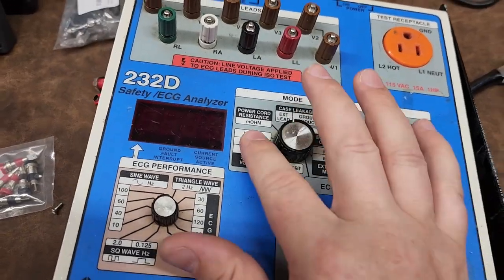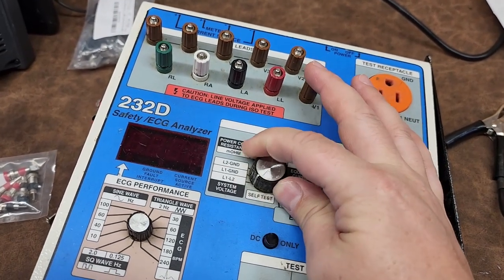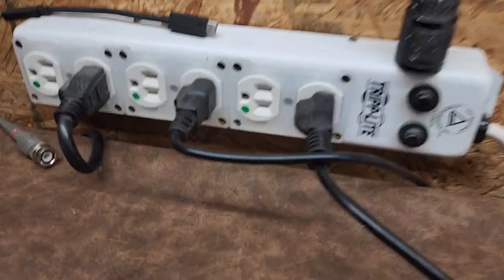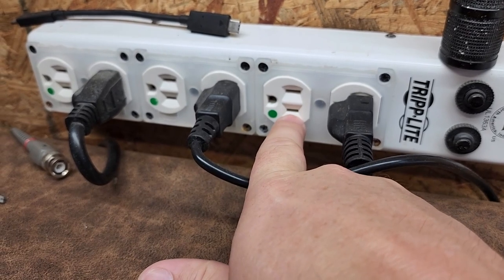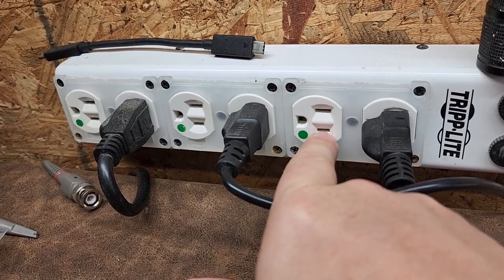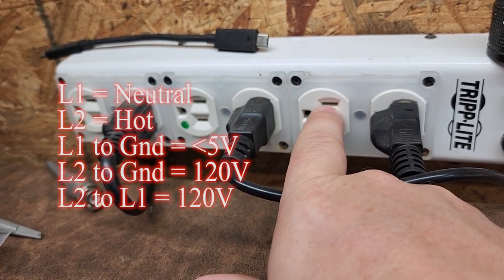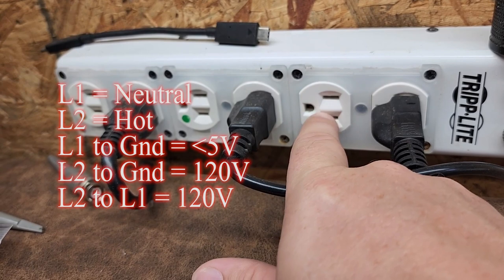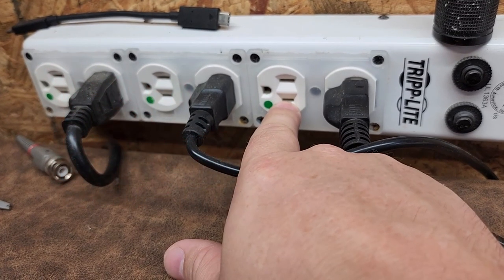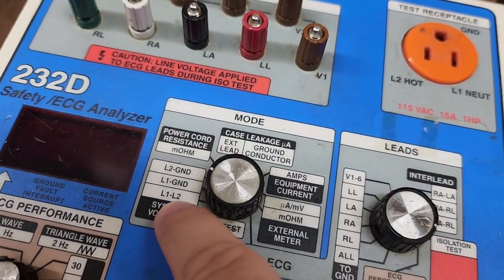Most of what we do is checking your mains voltage, because everywhere is different, and we used to roll through these to make sure you didn't have reverse polarity. On any outlet, between the small pin and your ground pin — that's your hot to ground, which should be 120 volts. Between neutral and ground there should be zero volts, except for isolated power systems where you'll see about 60 volts on each pin and 120 volts pin-to-pin.